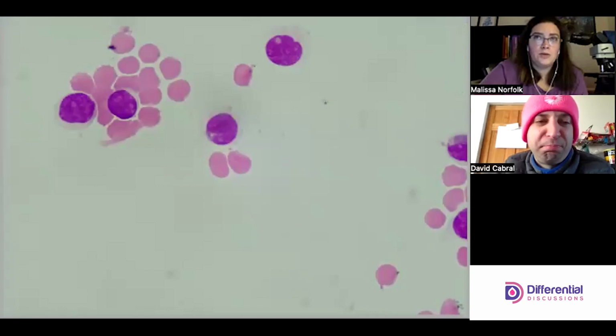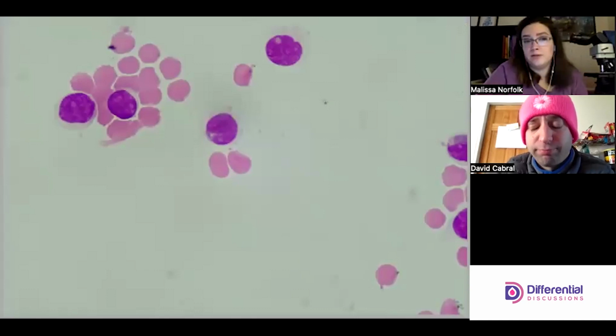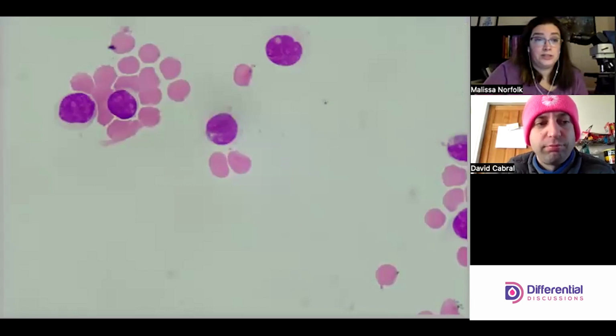When you're dealing with the actual patient specimens, absolutely collaborative. No one expects a new person, or even a new person to body fluid diffs, to be perfectly proficient. We expect lots of 'Hey, can you check this cell?' So ask away.